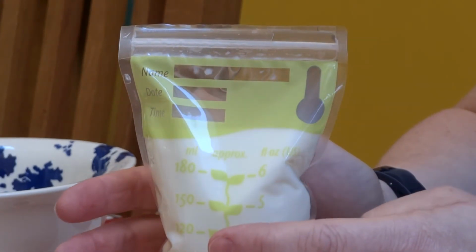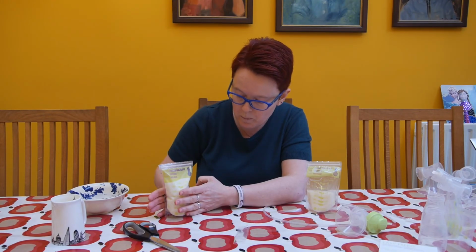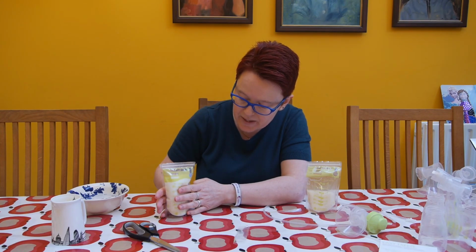So when you're reheating your milk, when you're warming it back up again, nice and gently, we don't want to use a microwave to heat breast milk. When we're warming the milk back up, when you notice that that gauge is completely transparent and clear, it's ready for baby.